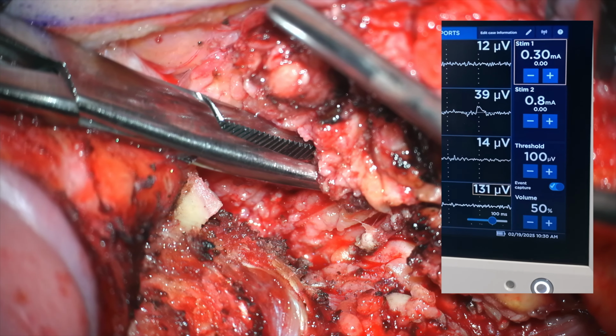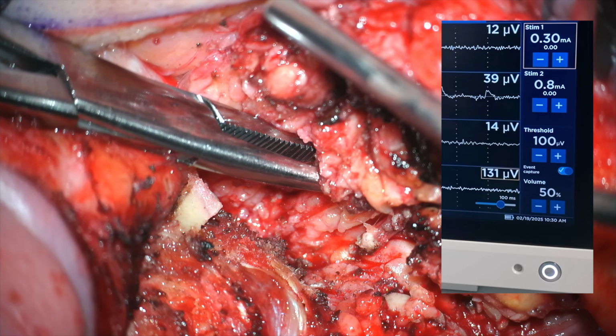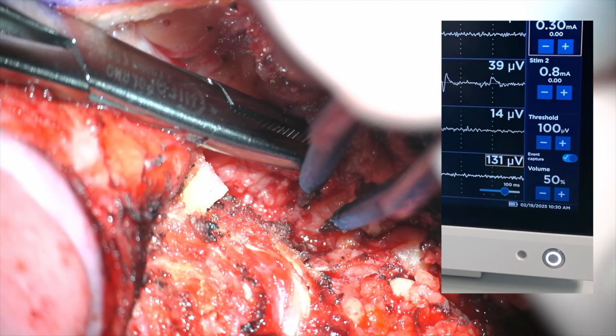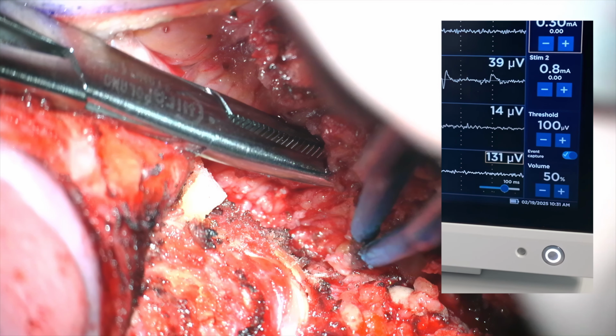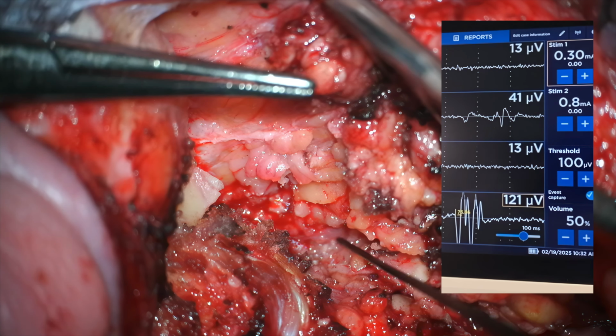Now, you can take your instrument, or you can use your bipolar. Just take the white thing out. Take that stuff that's just there. It's a little fascia on top of it. Bipolar, just spread it. Yeah, get that out. That's good. Right there. Good. That's it. That white is it. Okay. There. Right. Okay. That was a spontaneous act. Look. That's good. That's a spontaneous movement. That was completely spontaneous activity just from stretch.